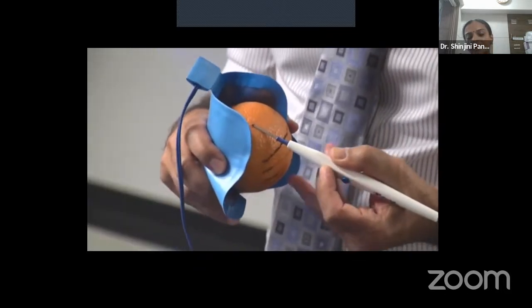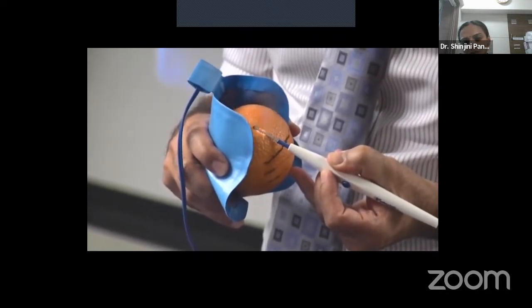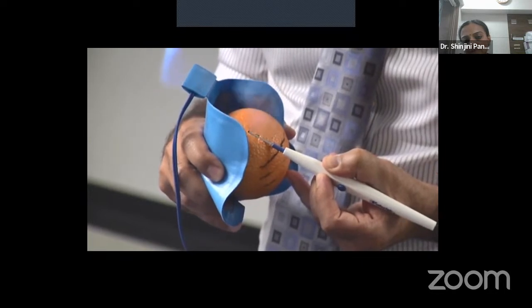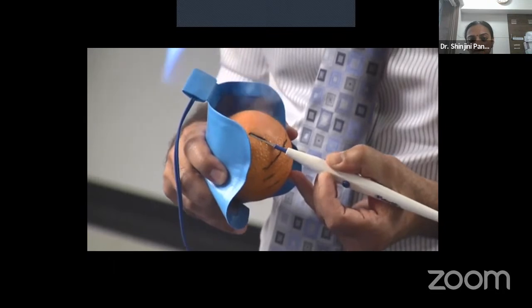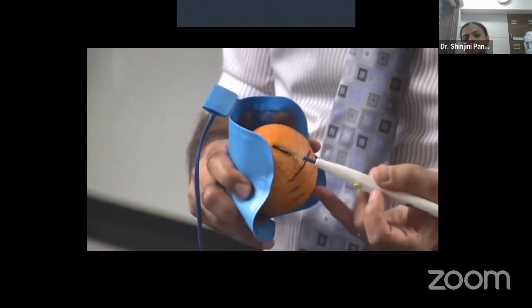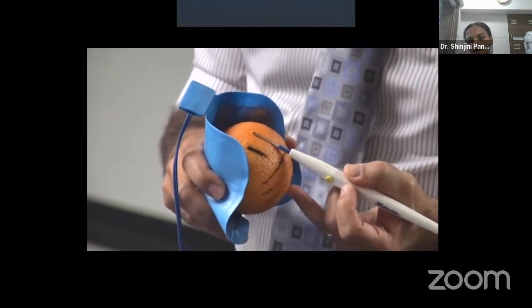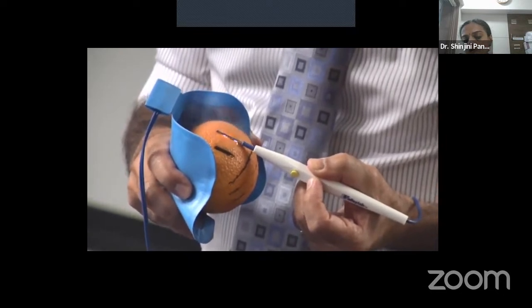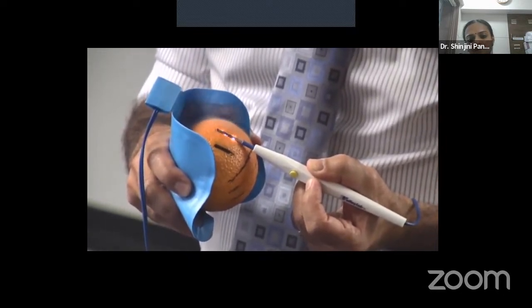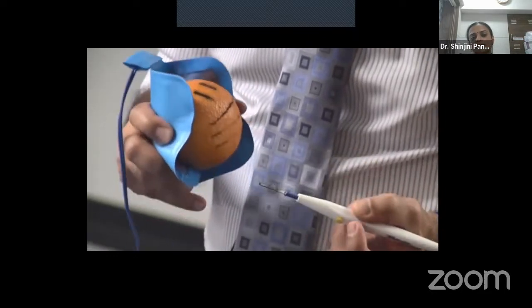Now with the same electrode, we are trying to show coagulation. So now on a yellow pencil, see now for the same time period, 1, 2, 3, 4, 5, 6, 7, 8, 9. Same seconds, this is with yellow. Now the same effect you are seeing with the blue button. Now you will see 1, 2, 3, same time period, same wattage on the generator. See the amount of sparks that are flying in the sky. And this is coagulation. Externally, it looks the same.